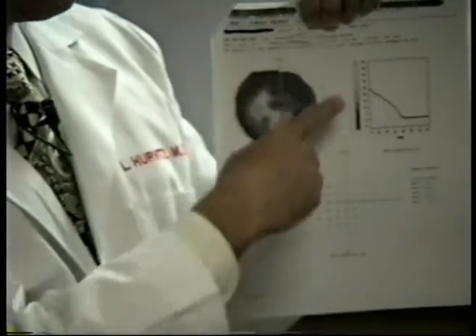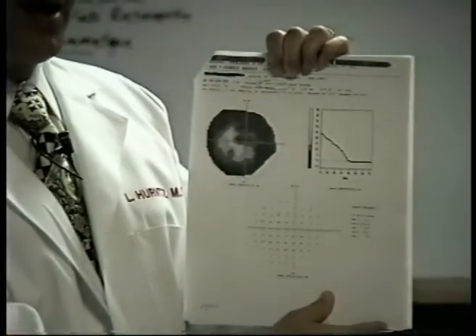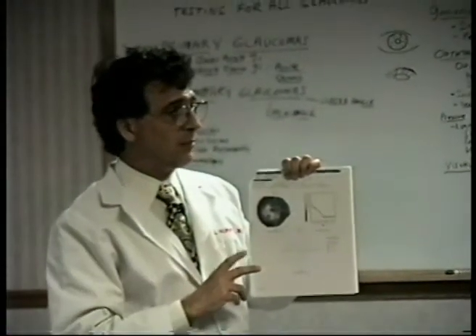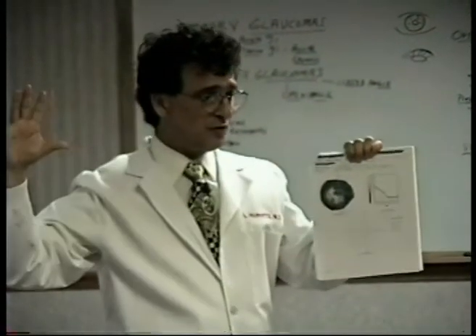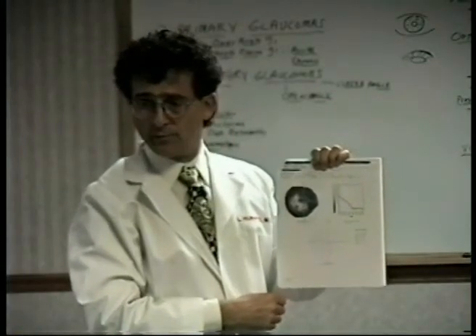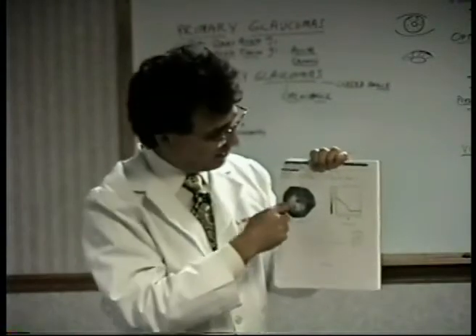So there are different ways you can use these visual field tests to test different parts of the vision, and depending on the stage of the disease, we do different programs with different spot sizes. Making sense to you now when I say this? And different sizes of tested area depending on what's left of the vision. Because if we took this person and tested them with that program in the very center, the whole thing would be black.